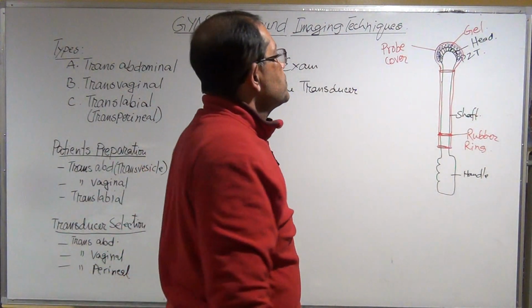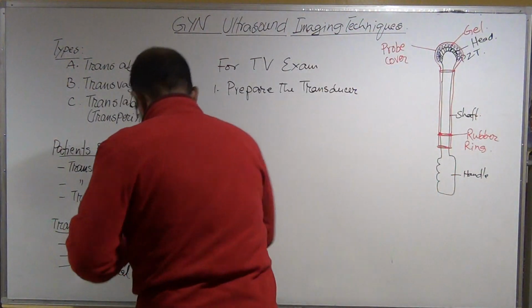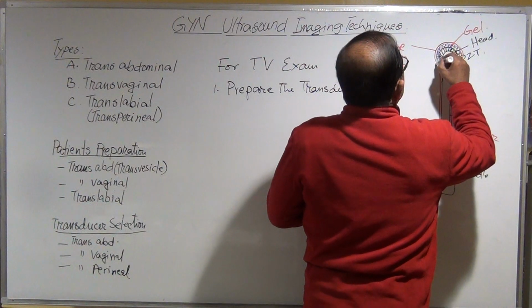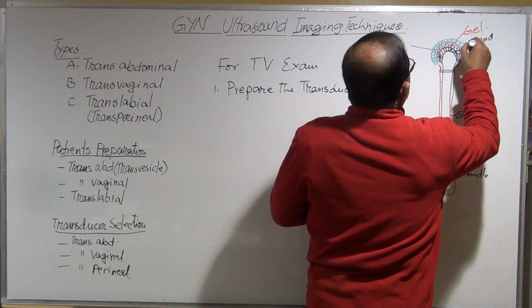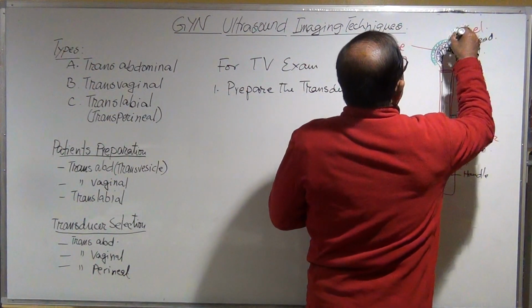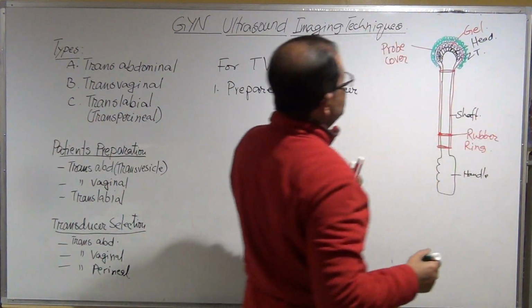Okay, so then put the gel on top of it again. Now this gel is acting as a lubrication.